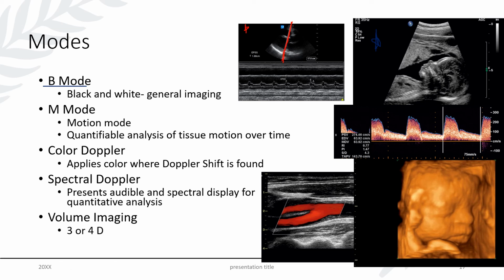So this representation that we're seeing here, this tissue is presenting tissue motion up in this general area. As we go deeper, we're seeing tissue motion here in the right ventricle. Here we're seeing tissue motion through the left mitral valve, and then here we're going to see tissue motion in the posterior wall. So it's showing you tissue motion all the way through along the length of that line. That is our M mode.